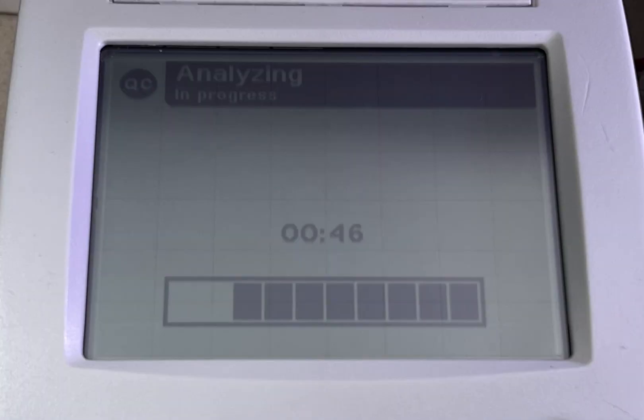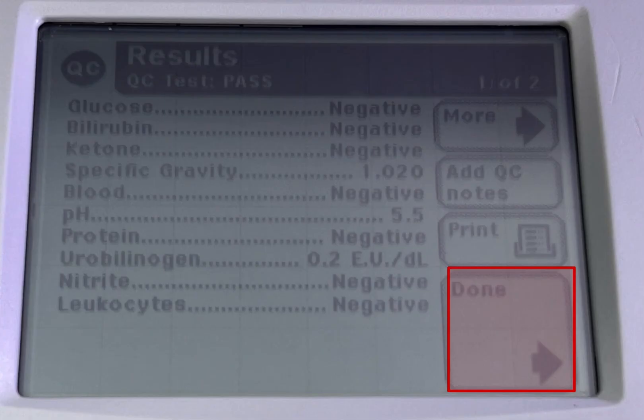Click start. It takes 45 seconds for the result to pass. When finished, click done.